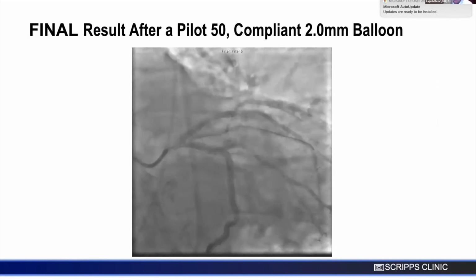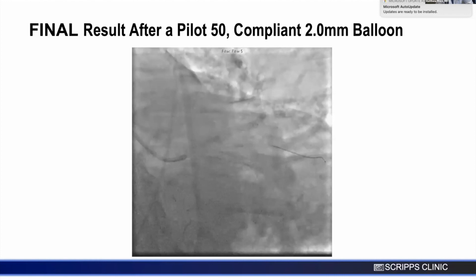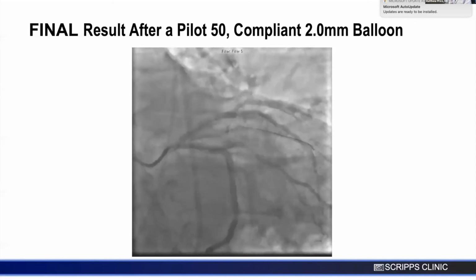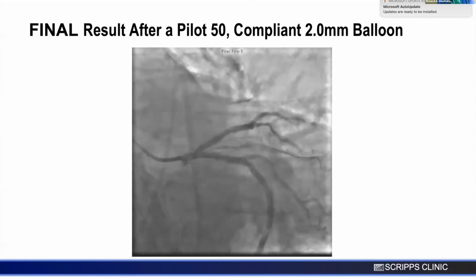My vote is that this is enough. Yeah, you've done enough for this patient. Is the chest pain better now though? Yes. Okay. And actually, I think this is it. That was my last. In fact, I didn't even take another picture because we were on the table for so long. I kept him overnight, and he went home the next morning without an issue. He had no pain or ST changes. So do no harm. I think it's good.